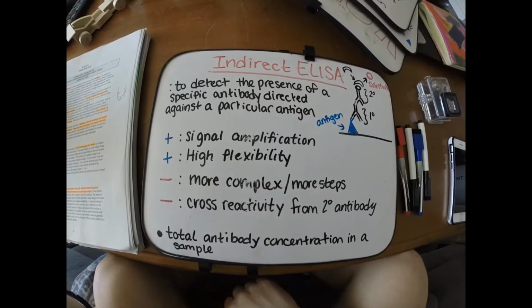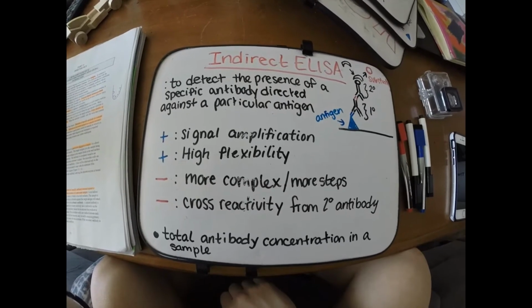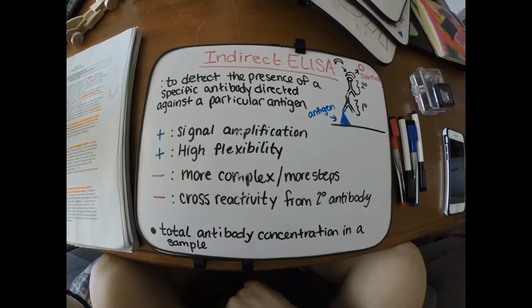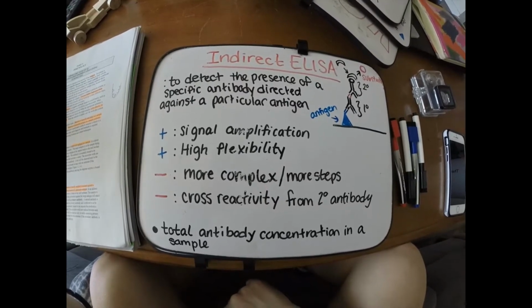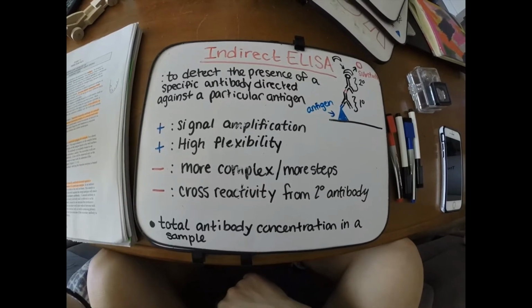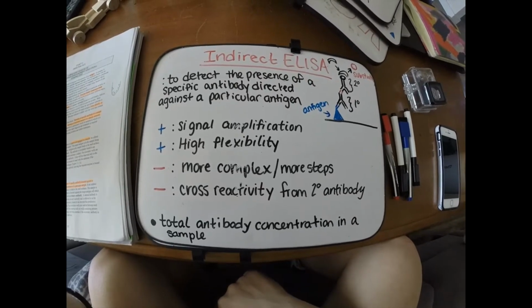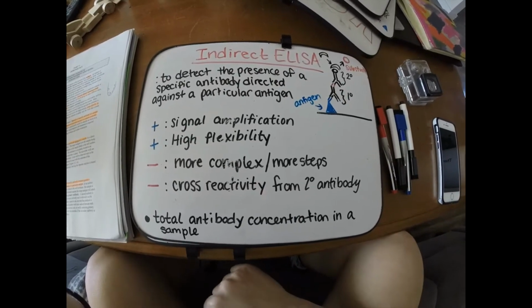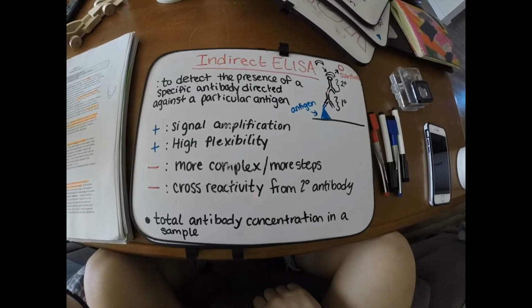antigen. So for example, let's say I'm working in the medical field, which some of you I know are aspiring to do, and I have a blood sample from someone and I want to know their total antibody concentration in that sample. I want to know what that is.